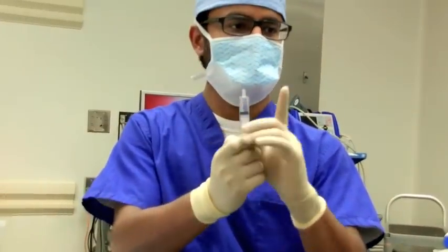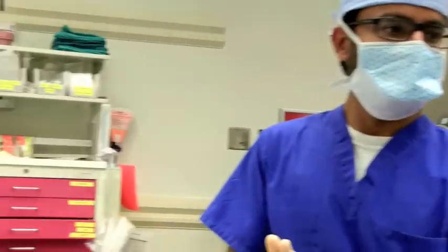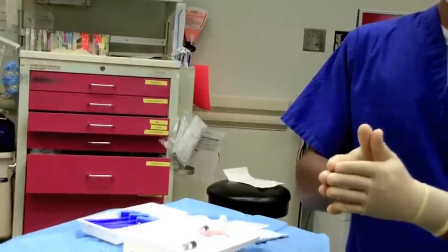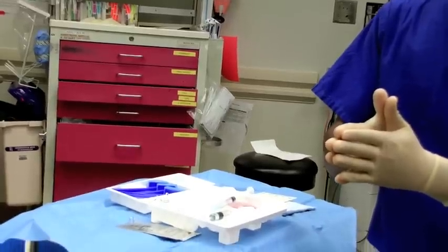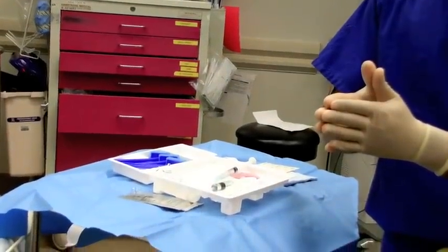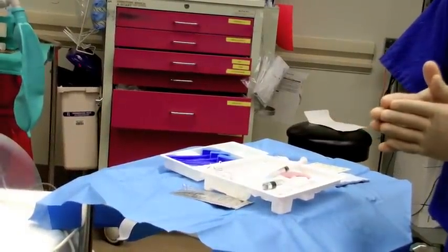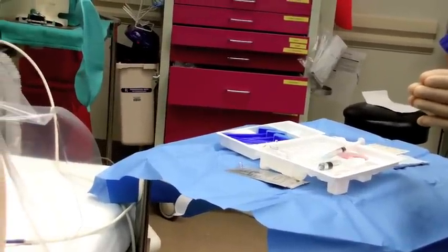Now, you're going to inject anesthetic in the correct location and angle. Superior aspect of the inferior spinal process in the midline. Approximately 15 degrees cephalad, as if aiming at the umbilicus. Horizontal plane perpendicular to patient's back, maintaining the needle in the midline position.